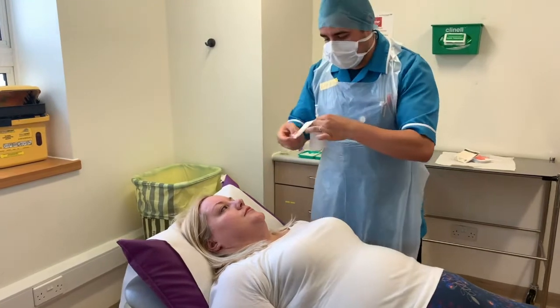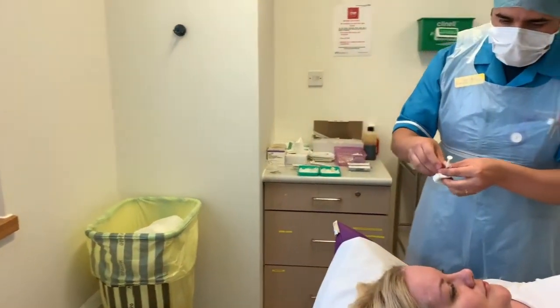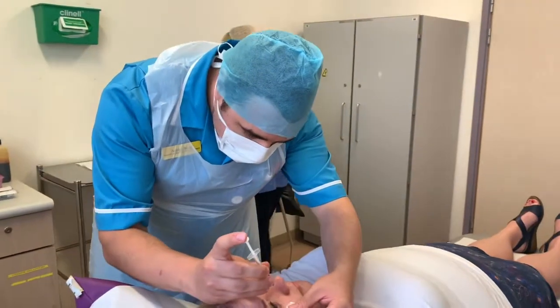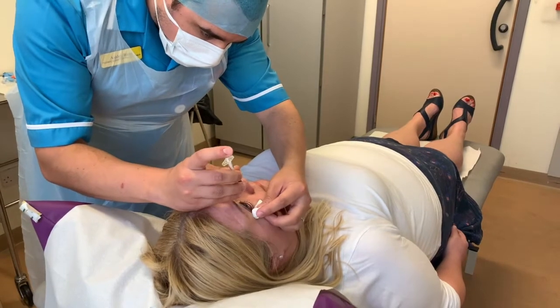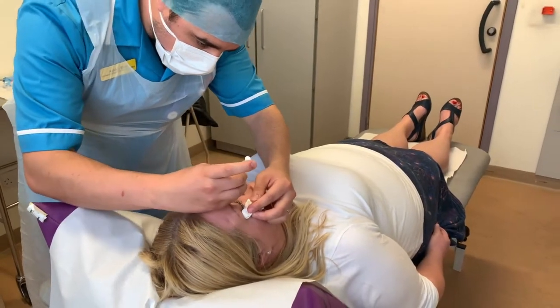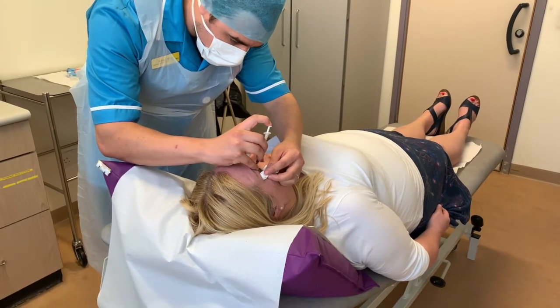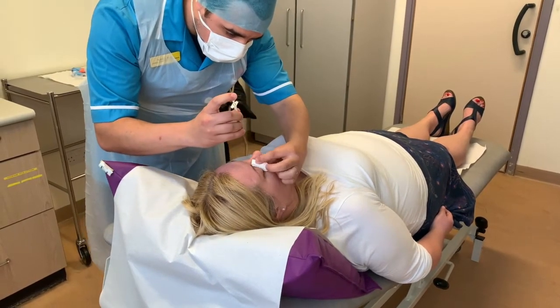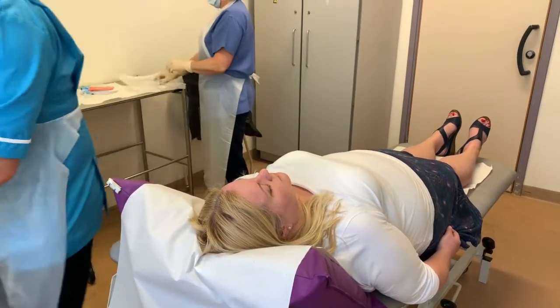Okay, so just clean the eye out and put some iodine in. Okay, if you have a look up for me. Close the eye gently. Look down now. Close gently. Fantastic, thank you.